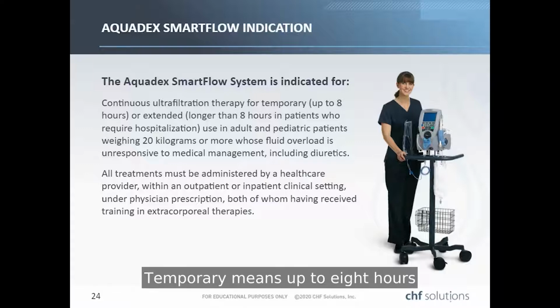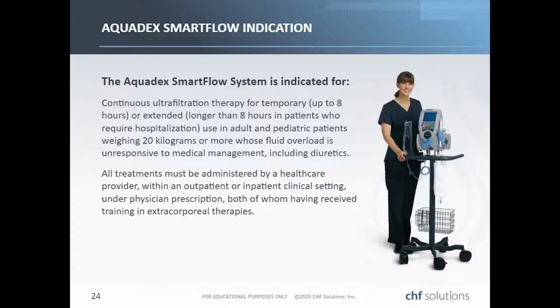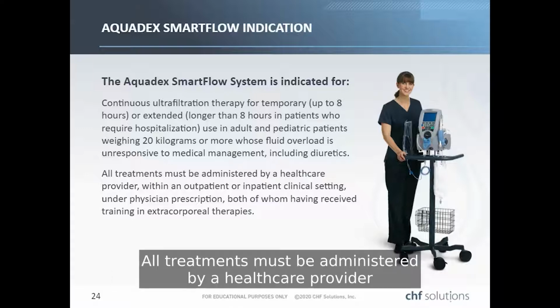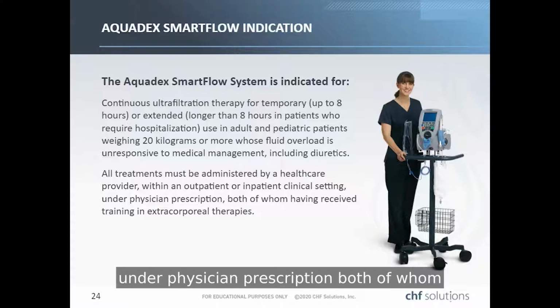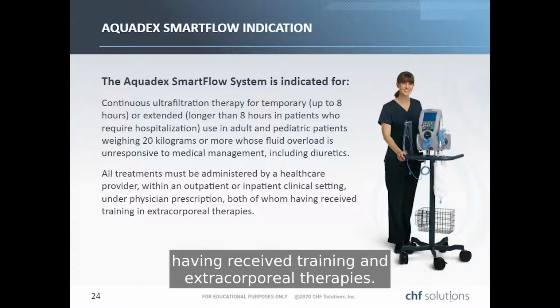Temporary means up to 8 hours, or extended means longer than 8 hours in patients who require hospitalization. All treatments must be administered by a healthcare provider within an outpatient or inpatient clinical setting under physician prescription, both of whom having received training in extracorporeal therapies.